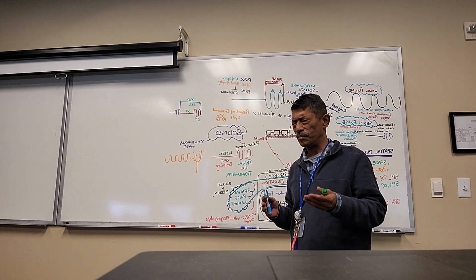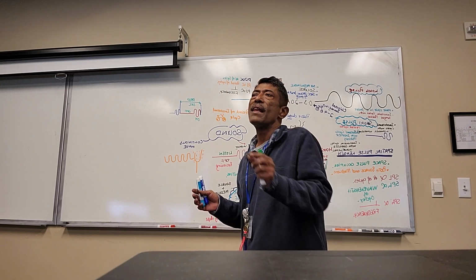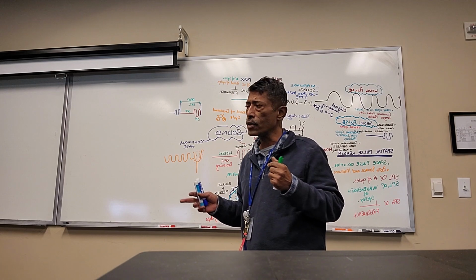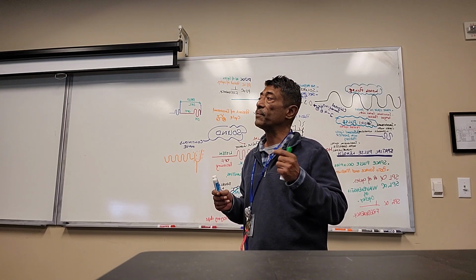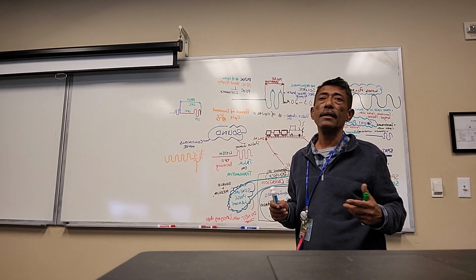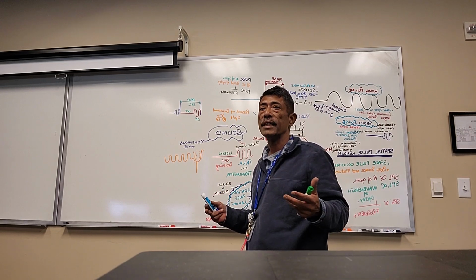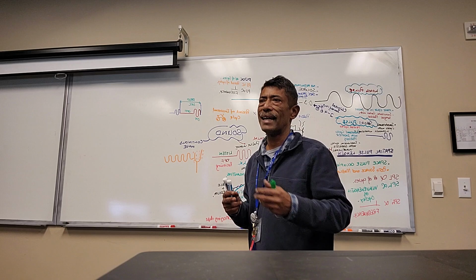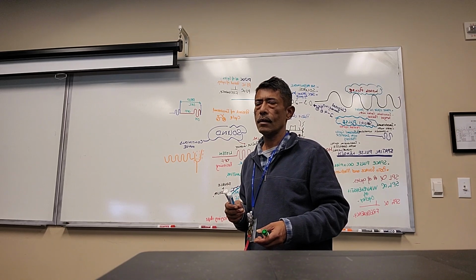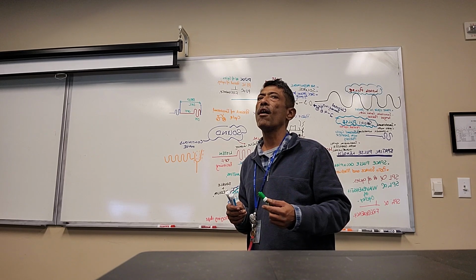If it's scanning something superficial like the pancreas, then we have a lesser listening time because it's going to strike that desk and come back to that podium, right? But if it has to go all the way to the back and strike the wall and then come back, as if I'm imaging a structure situated deeper in the body, like the kidneys, it will take more time. What lengthens? The on time? No. Or the off time?